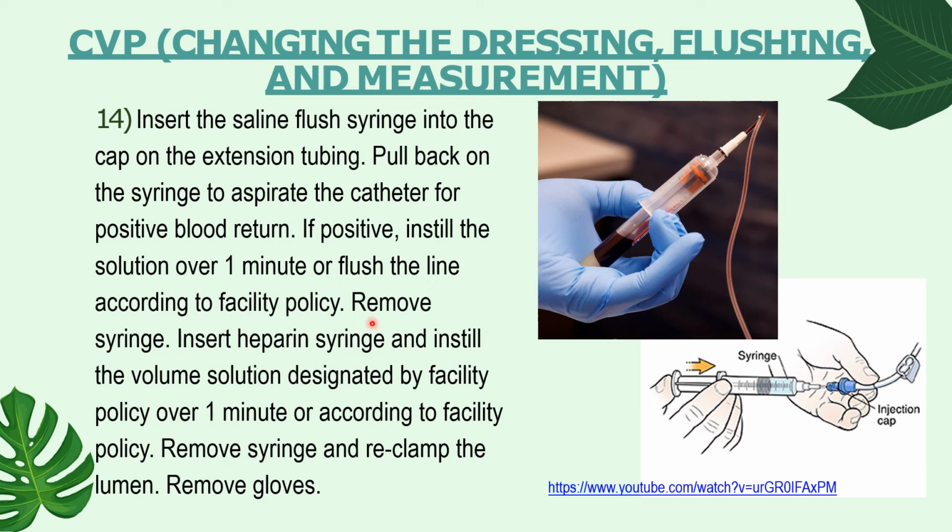Now remove the syringe and insert the heparin syringe and instill the volume of solution designated by facility policy over 1 minute, or again according to facility policy. Now you can remove the syringe and re-clamp the lumen, and then remove your gloves.